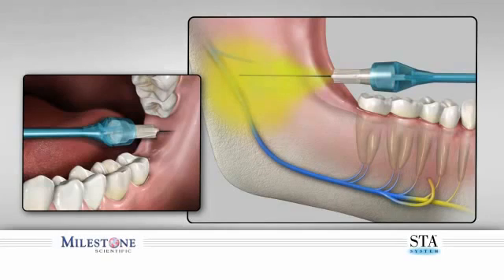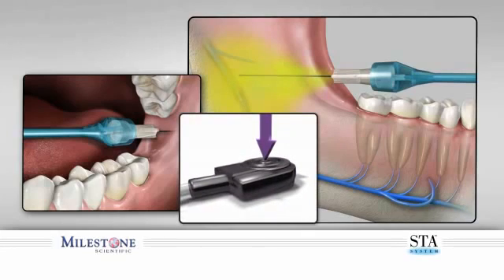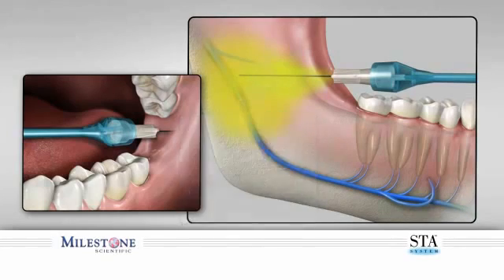It is recommended that the first 1/4 of the cartridge be dispensed using the control flow rate before you transition to the second faster rapid flow rate. The rapid flow rate is used during block injections, only after your patient has acknowledged that they have achieved soft tissue anesthesia of the area being injected. This is acknowledged by subjective statements elicited from your patient.